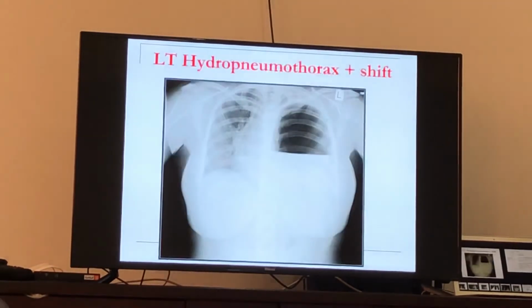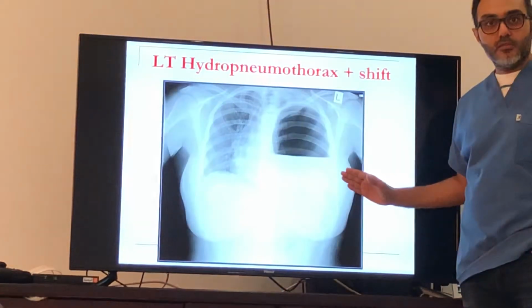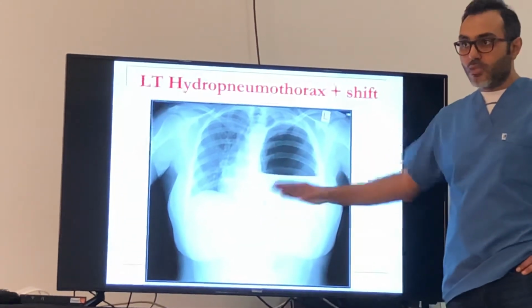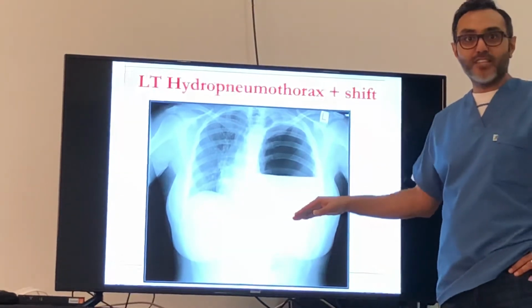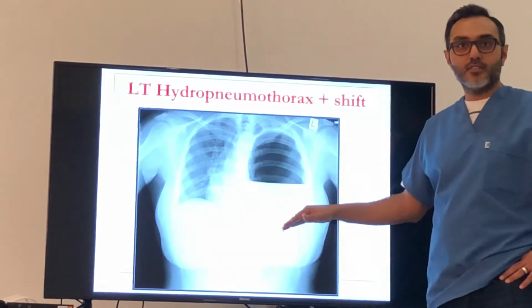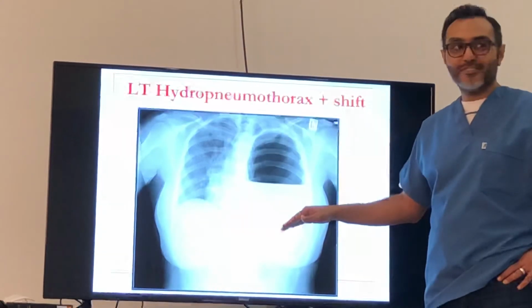Okay, let me ask you a question. So here, when there is pneumothorax, the tube is usually directed up, and with fluid it is directed down. So what about this case? Where do we do it? A bit up, then a bit down? No, we don't put one up and one down.